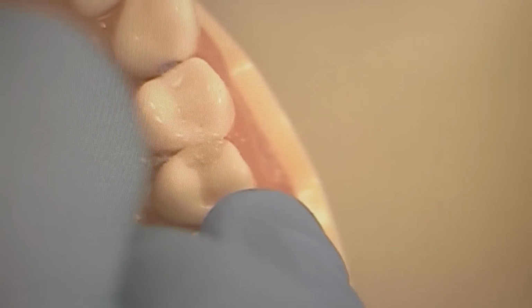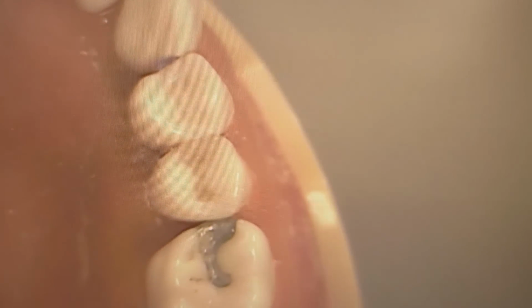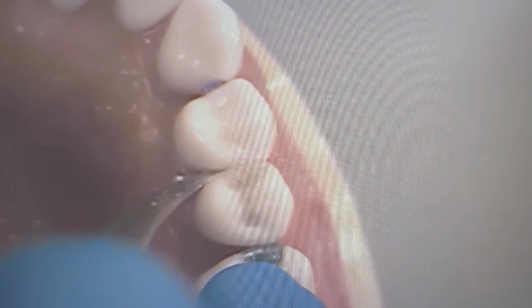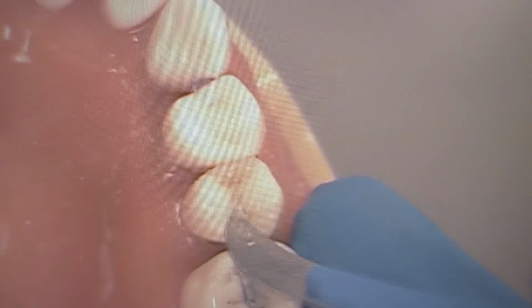With the 12 blade, you want to adapt and not cut straight into it. Correct. I just want to move this. Yeah, it's okay this way, right? So then that contour. See how it's still a little bit over contoured? And that's because the wedge was placed a little bit too tight. Remember, don't over wedge.